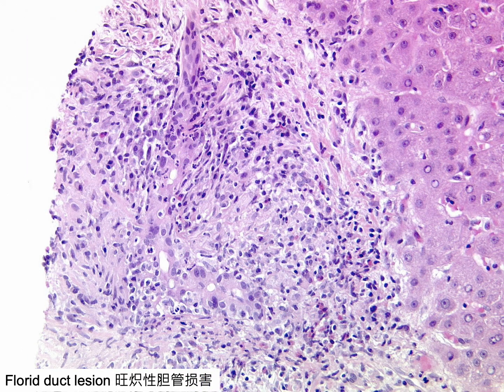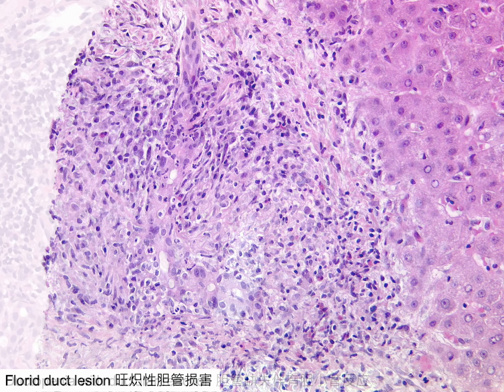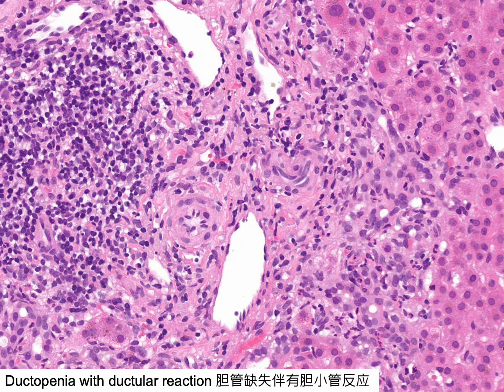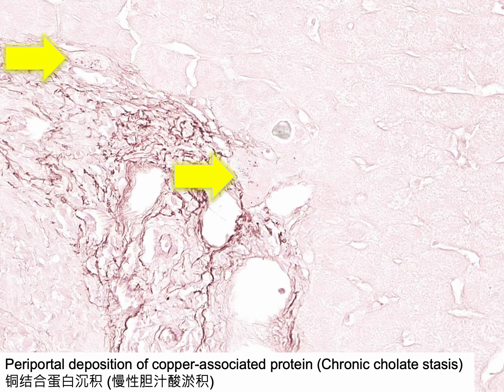This portal tract features a florid duct lesion, characterized by a damaged interlobular bile duct surrounded by a dense lymphohistiocytic infiltrate. A portal tract displays an unpaired hepatic artery lacking its accompanying interlobular bile duct, with a prominent ductular reaction. The presence of copper-associated protein in periportal hepatocytes indicates chronic cholestasis, signifying prolonged retention of bile acids and salts in hepatocytes due to persistent impairment of bile flow. Feathery degeneration is another histological indicator of chronic cholestasis.